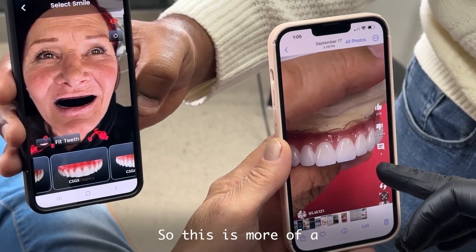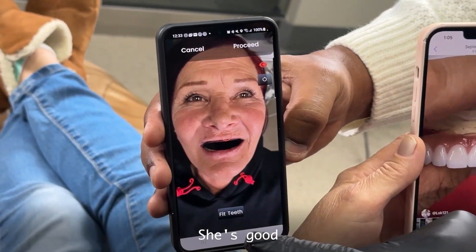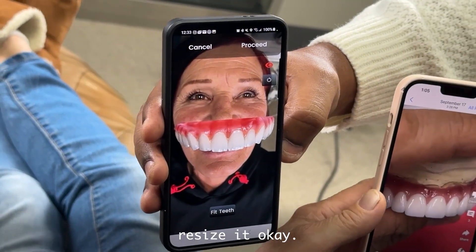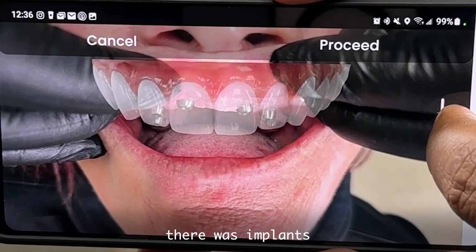I'll let you know. So this is more scale types. We can go to scale — she's good. I think we'll be good. You're going to resize it when we do it. So we can resize it. Okay, that was implants.